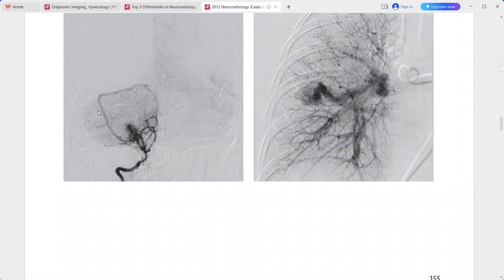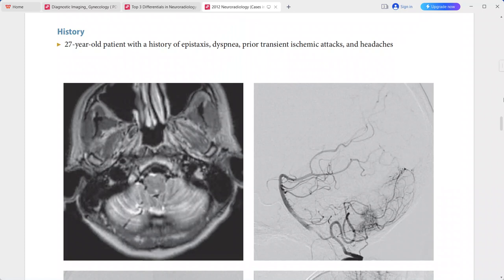There is an abnormal tangle of vessels with an early phase draining vein. The pulmonary arteriogram shows abnormally dilated vessels and early filling of enlarged venous channels, consistent with a pulmonary arteriovenous malformation (AVM).